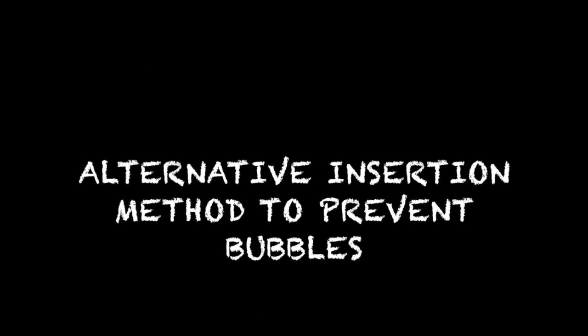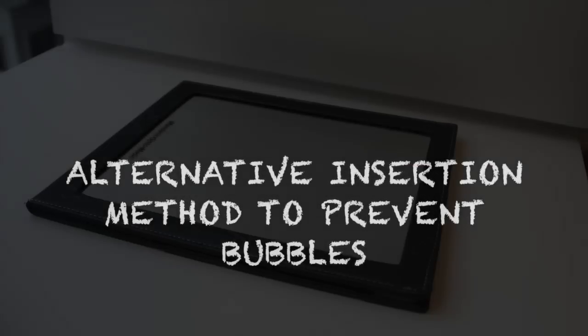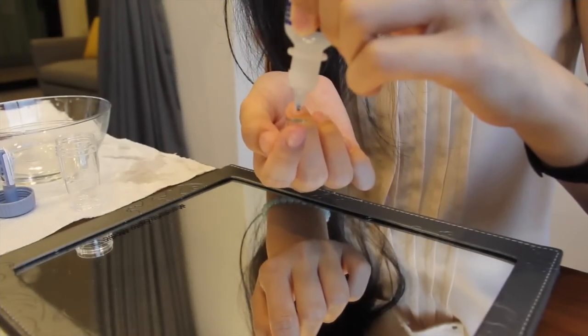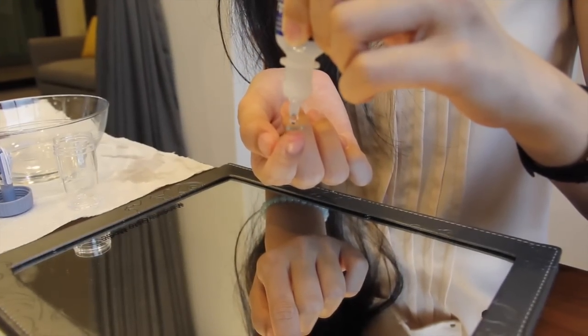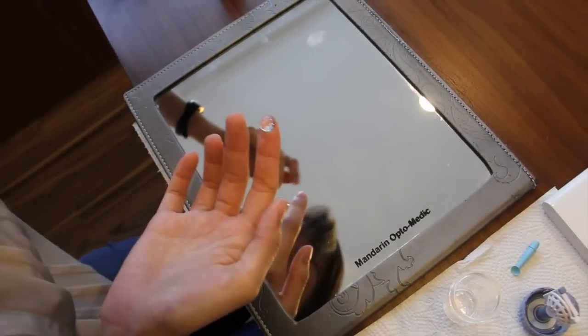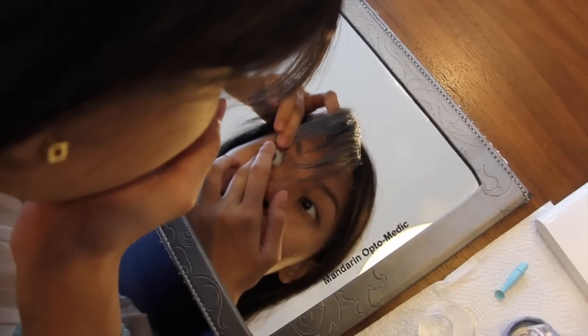There is an alternative method to insert the lens to prevent bubbles from forming. All you need is a flat mirror. Fill the lens with eye drops to the brim. Insert the lens the same way, but with your head down, parallel to the table.